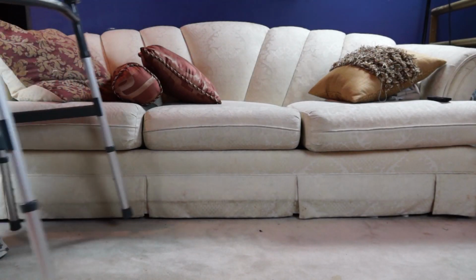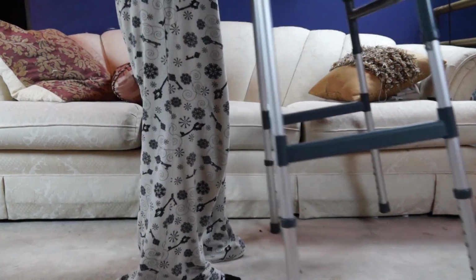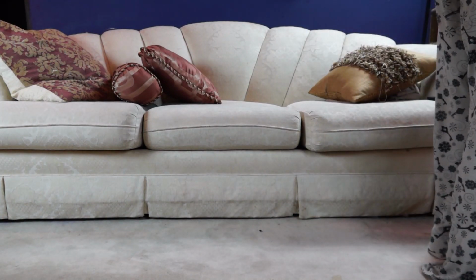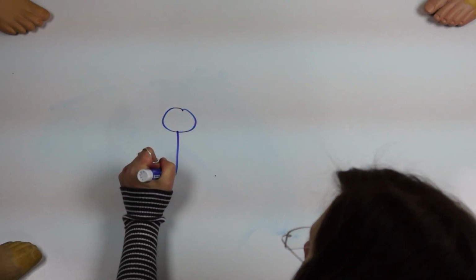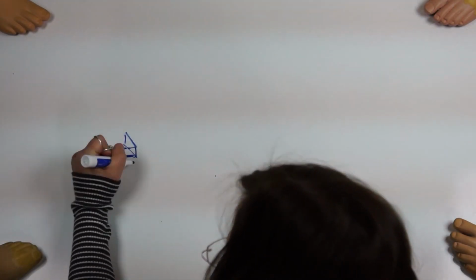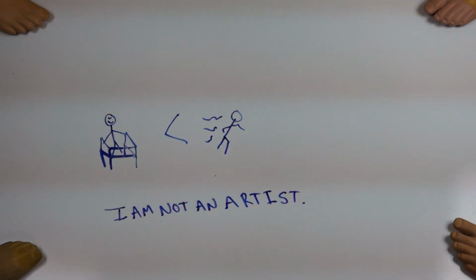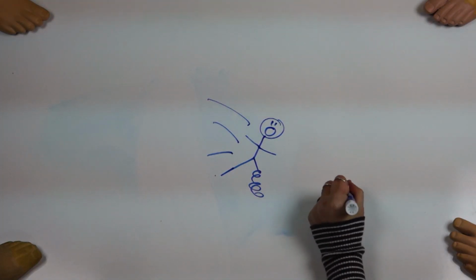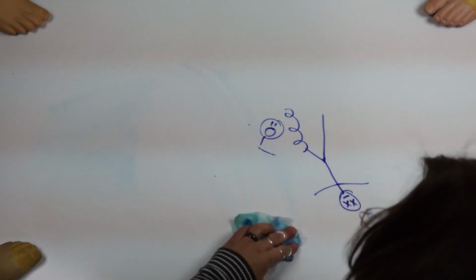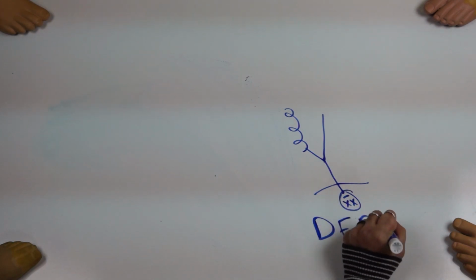For example, if you have a geriatric person who's not going to be able to use their prosthetic for any more than transferring from their bed to their commode, then you don't want to give that person the most expensive energy storing foot because, for one, the energy storing capabilities of that foot will not match that person's mobility level, so that person will not get full use out of those prosthetic components. Or two is that the prosthetic components might be uncomfortable for them or might have so much energy return that basically it's like putting a spring on the bottom of their foot, and that's going to cause them to have impaired mobility and to fall over.